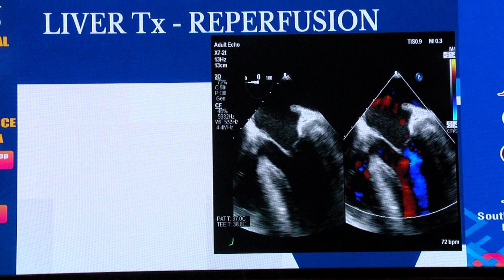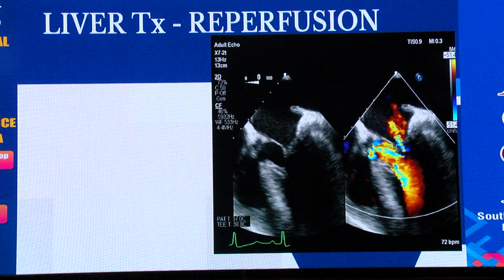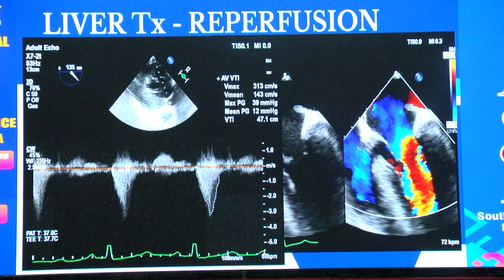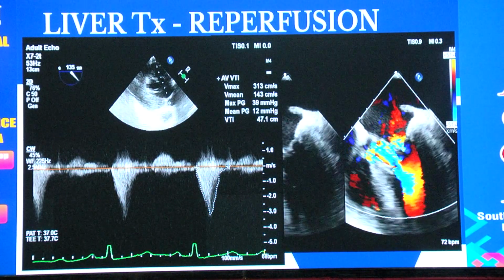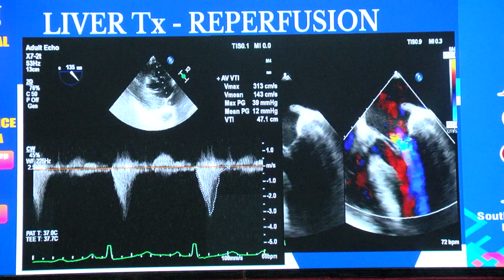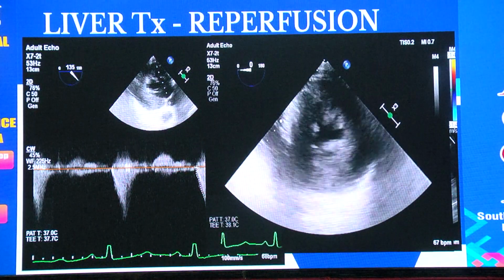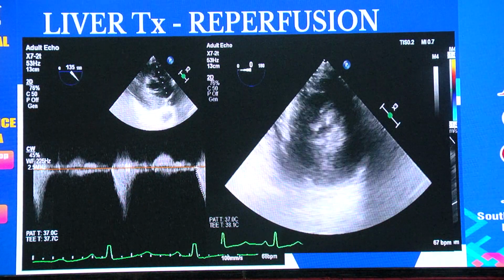And as he rightly told, you can also end up seeing this when the patient is hypovolemic. What is this? See, I put a gradient across the aortic valve. You get a gradient roughly around 39 to 40, which is very, very significant. It tells that there is a gradient across the LVOT, which is SAM, systolic anterior motion. That's why it's very lethal to understand this. You see the heart, probably it's hypovolemic, and you have started giving some vasopressors, which will again increase the SAM.